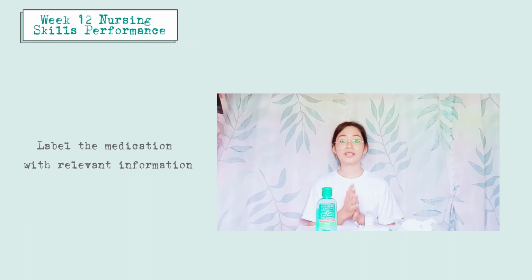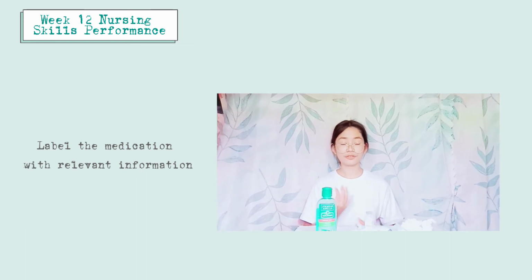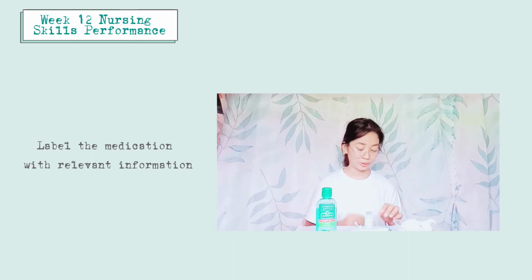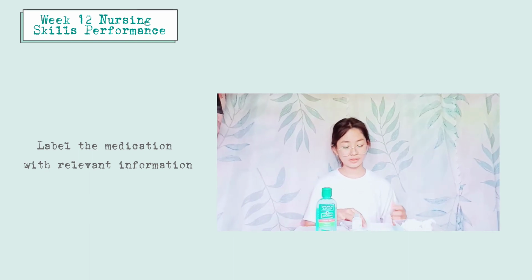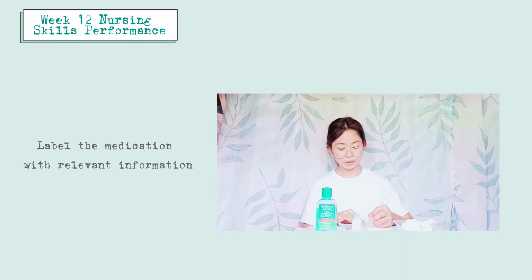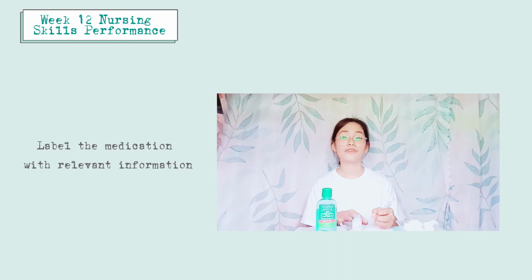Afterwards, label the medication with the relevant information needed. We're going to write here the name of the patient, and the relevant information like the 5R.